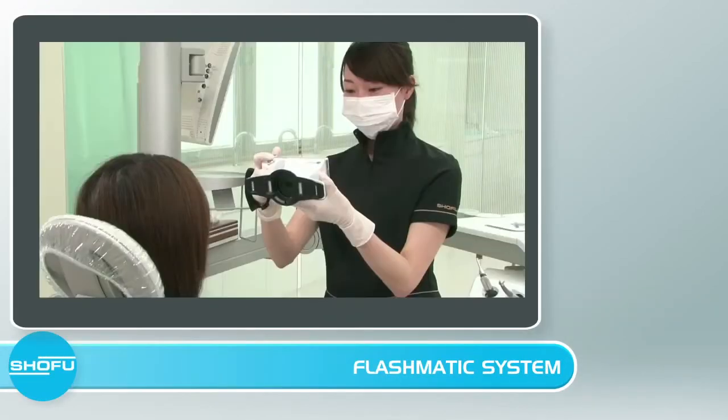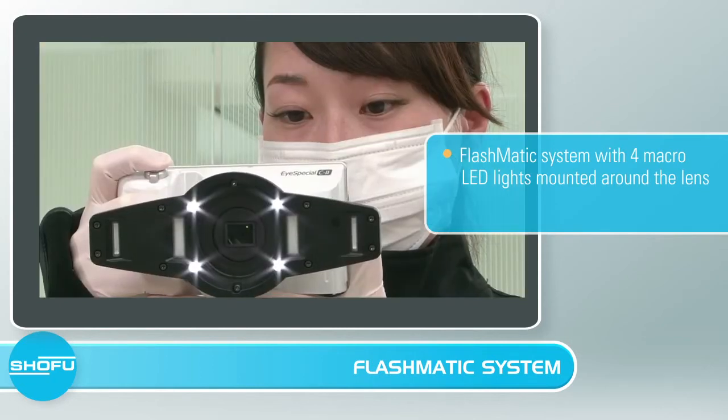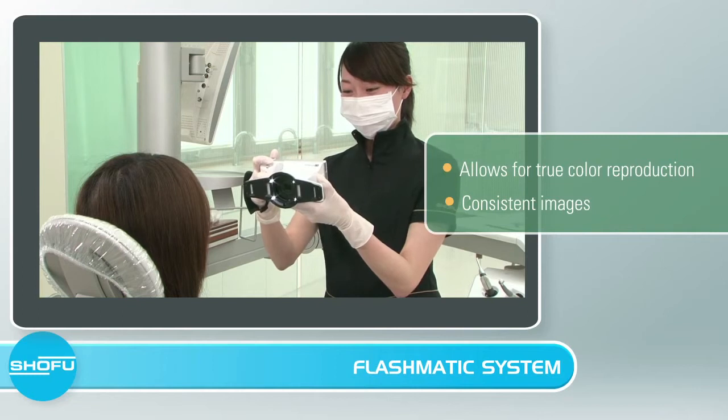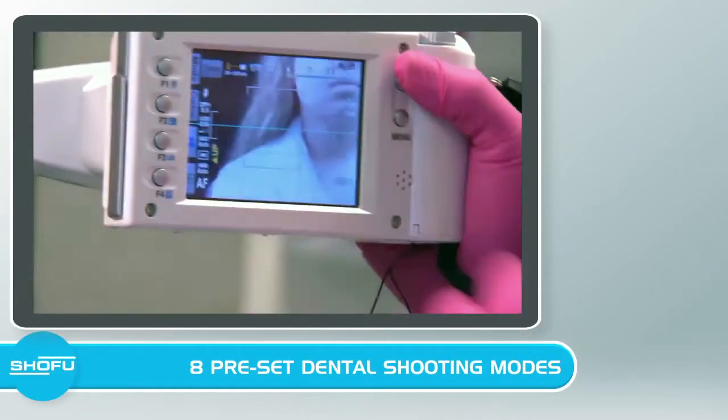The iSpecial C2 features the Flashmatic system with four macro LED lights mounted around the lens, as well as an inside and outside flash located on both sides of the lens. This Flashmatic flash system blocks out the ambient light, allowing for true color reproduction and consistent images to be achieved every time.